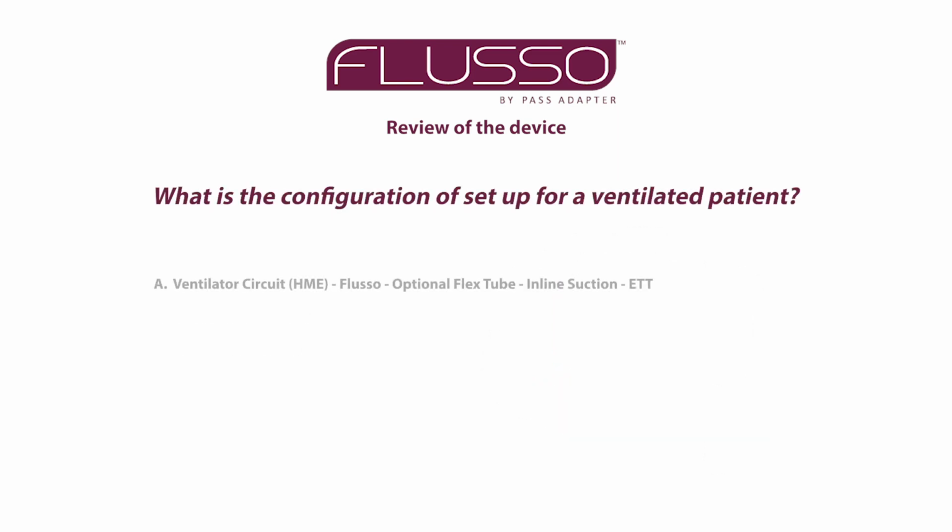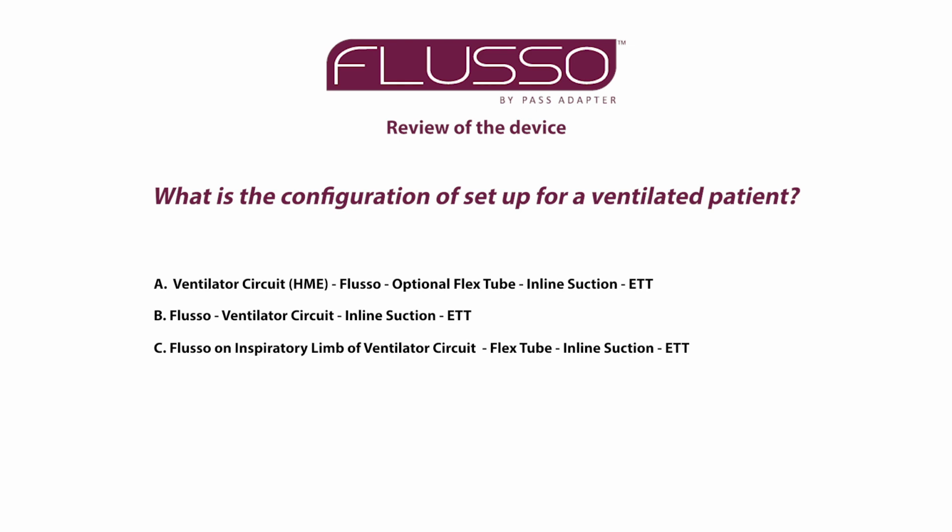What is the configuration of setup for a ventilated patient? A. Ventilator circuit. Flusso, optional flex tube, inline suction, and ETT. B. Flusso, ventilator circuit, inline suction, ETT. Or C. Flusso on inspiratory limb of ventilator circuit, flex tube, inline suction, and ETT. The correct answer is ventilator circuit, then Flusso, optional flex tube, then inline suction, and lastly ETT.